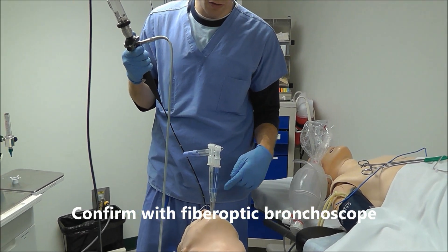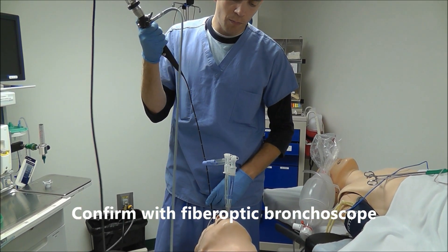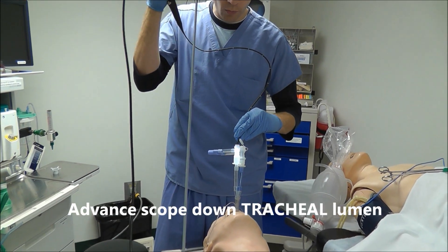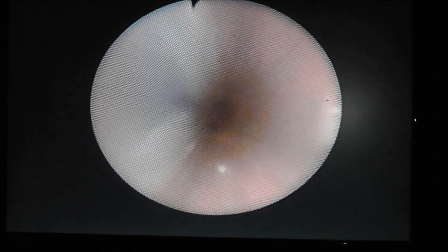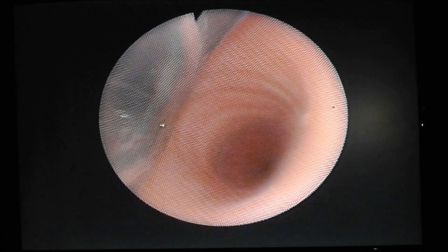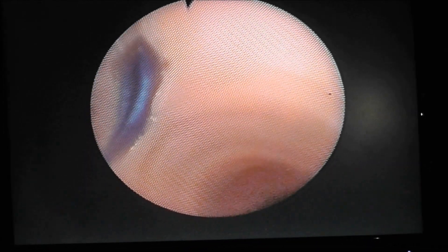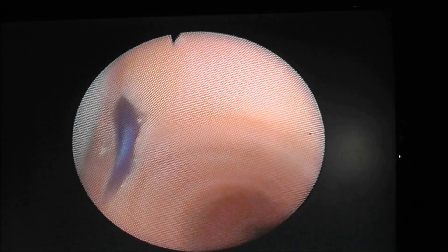The second way to verify correct placement of the double lumen tube is to use a fiber-optic bronchoscope. The best way to do that is to open the cap to the tracheal lumen and insert the scope down into the tracheal lumen and look at the level of the carina. As we advance, we come to the carina. We can see that the right main stem is open, and you can see that blue cuff occluding the left main stem — that is perfect placement of a left double lumen tube.